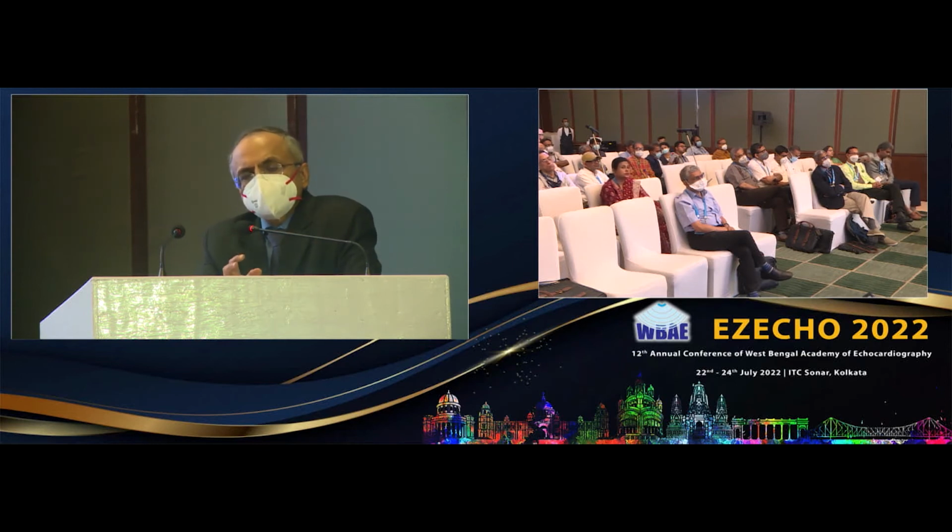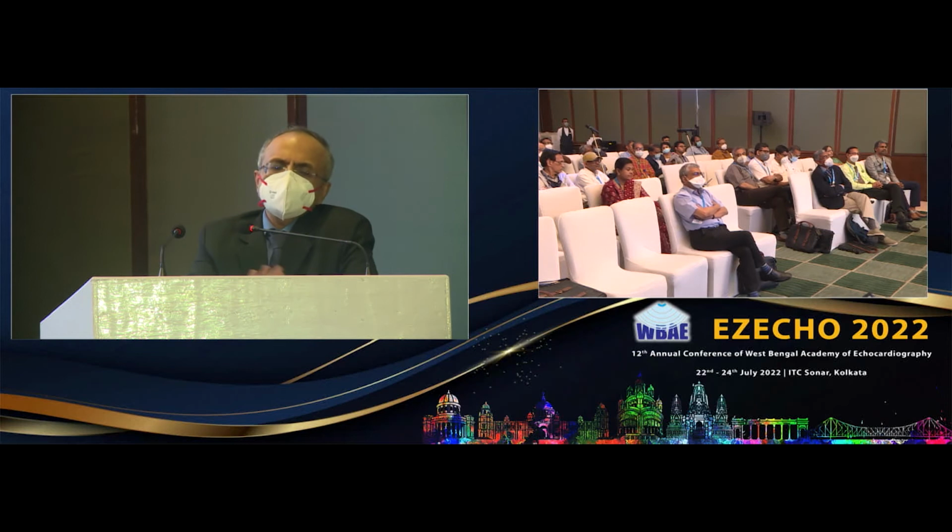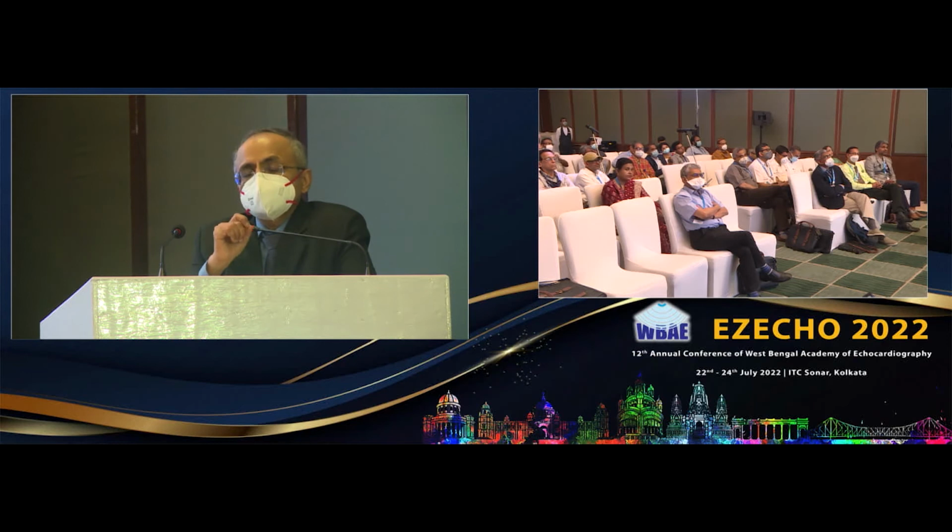Secondly, if you have an athlete with a possibility of an underlying HCM, there again the MRI comes in handy by looking at the LGE patterns, whether it is a real phenotype of a sarcomeric HCM, or it is just because of overtraining that he has hypertrophy. Because in athletes there will be no ECV expansion, and neither will there be this kind of lacy pattern of fibrosis, except that marathon runners, the master athletes, do develop some LGE at the insertion site because of the continuous training and some kind of RV pressure overload. But that is late.